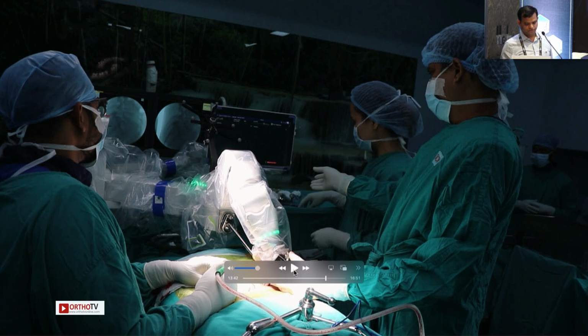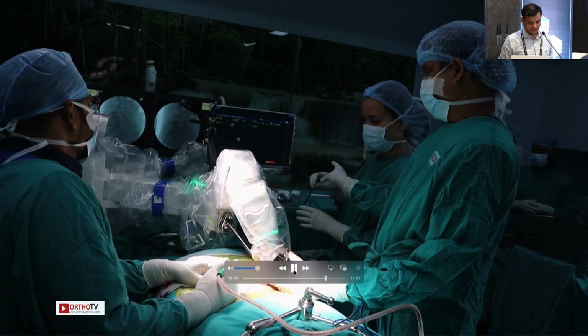Soft touch. The other thing with the Excelsius one is that it has got a knife also. But I don't use that, because to cut the deep fascia with it, your robotic arm moves sometimes. That is why I tend to take away the robotic arm and make a good generous skin incision with deep fascia, because ultimately the post-operative pain, if you don't cut the deep fascia, is really troublesome.